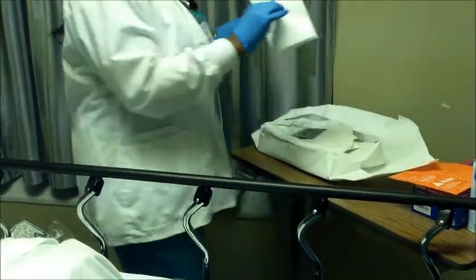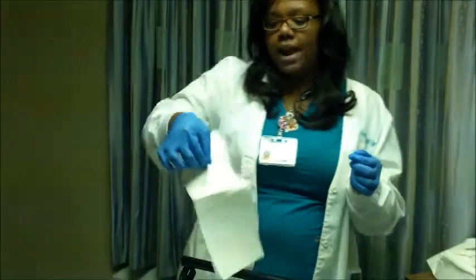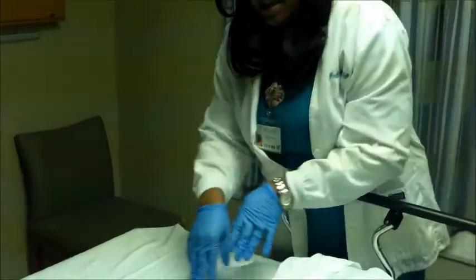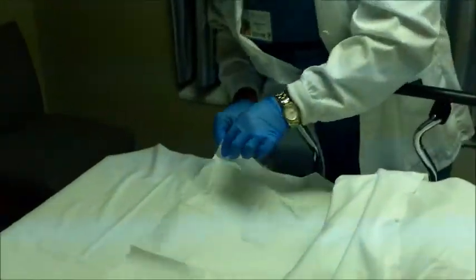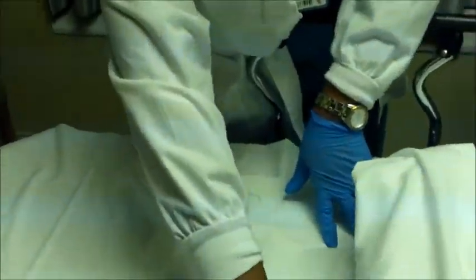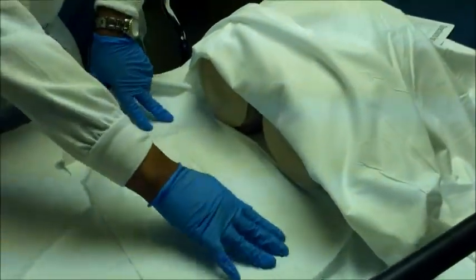This here is the sheet that I'm going to drape with the patient. I want to make sure that I use the shiny side down. That's going to go down. I'll have my patient lift up the bottom a little bit, and I want to slide this under him. Once we're done, I'm going to lift this up and place this here. I want to keep privacy and keep my patient covered up.